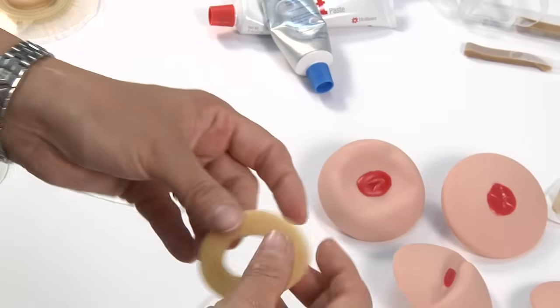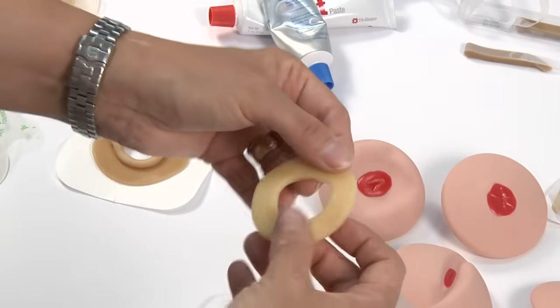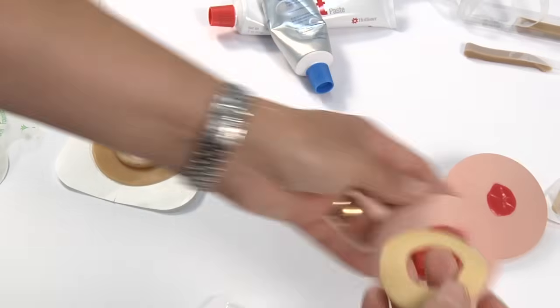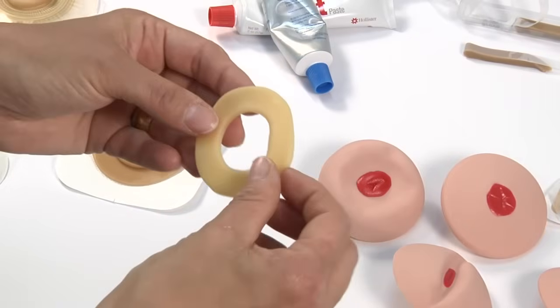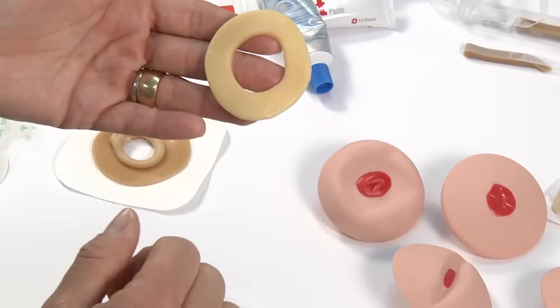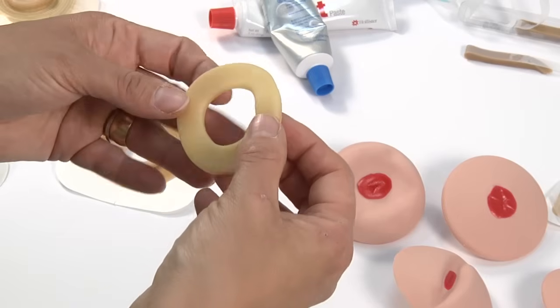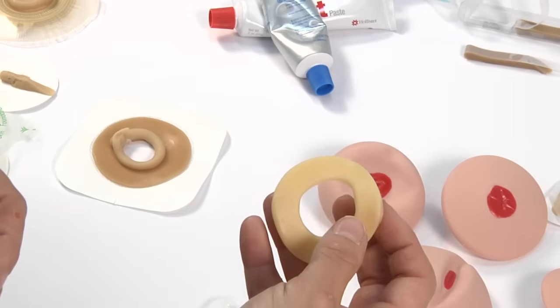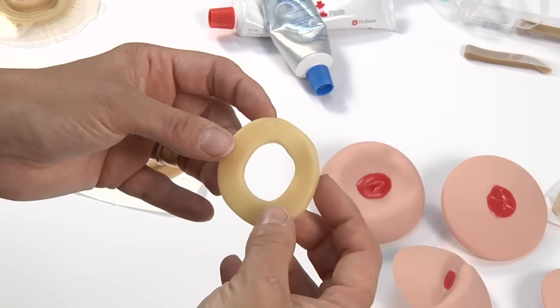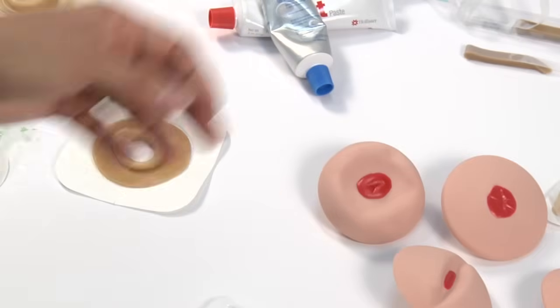But if you have an oval shaped stoma, you can actually stretch it out to the oval shape. But if you have a round shape, you can actually, again, put that over top of the stoma. The one thing with all of these barrier accessories is that they have no plastic shield or covering that actually helps to support it, like you would see with a barrier. So that means that these can actually touch the stoma and you're not going to be concerned about laceration or any kind of damage to the stoma itself.